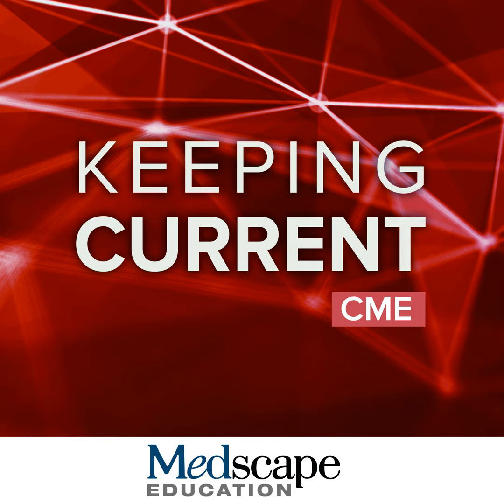And the lesion was followed, of course, and was stable over 2 years. And if you look at the LIRADS table, this lesion had non-rim APHE. It was between 10 and 19 millimeters, but didn't have additional major features, so that is a LIRADS 3 and should be followed over time. So that case is not too complicated. Let's talk about this one.